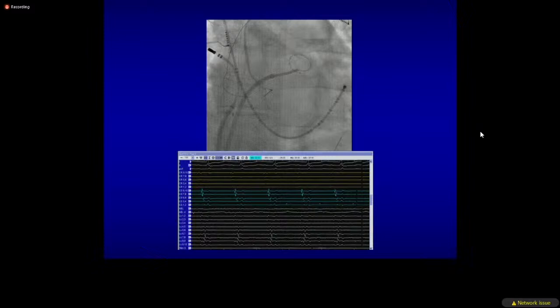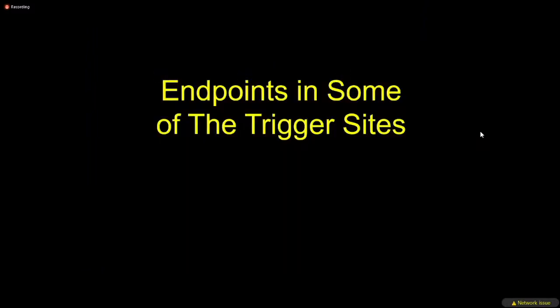Again, the idea is more information, in a way that doesn't increase the chance of mechanically induced arrhythmia, because on 20 or 30 mics of isoproterenol you have a lot of boom, boom, boom. So if you have a contact force catheter, you're going to see a lot of mechanically induced things that are irrelevant. So you really have to use this mostly floating electrode approach to be effective.